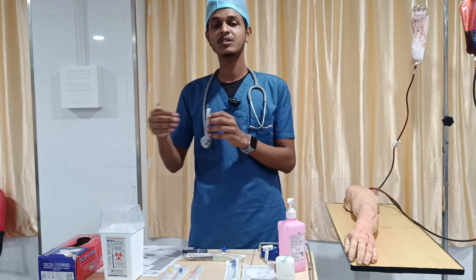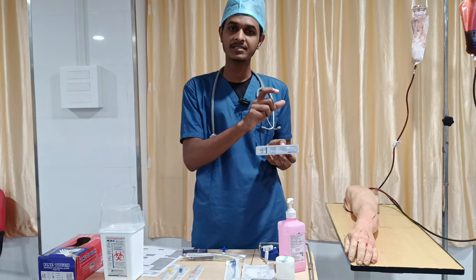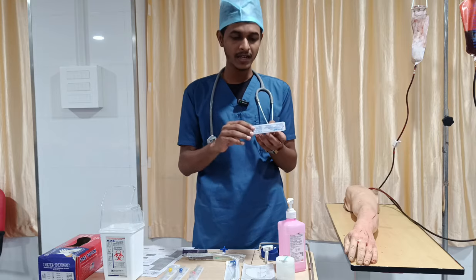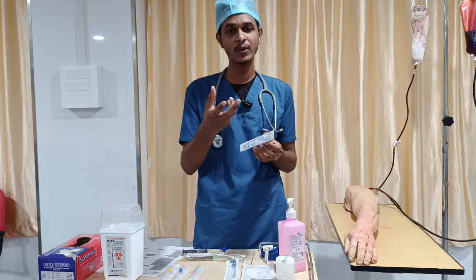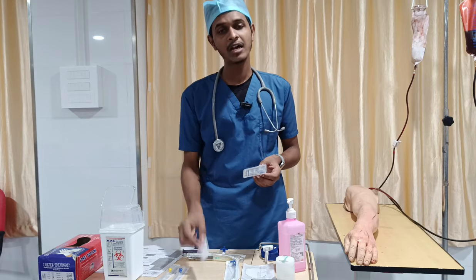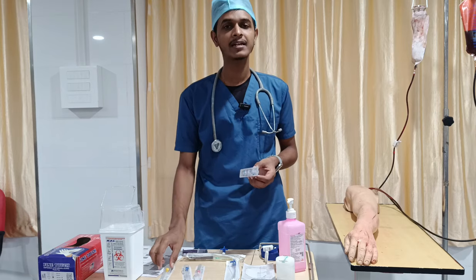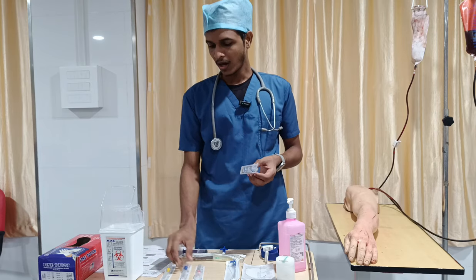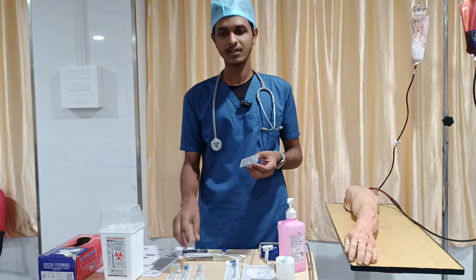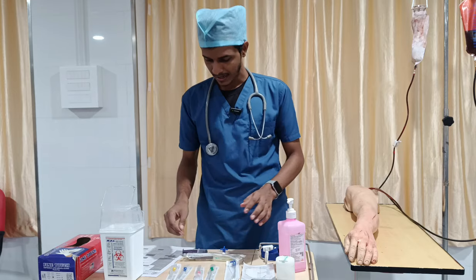If you want to administer aggressive fluid resuscitation, there also you have to choose larger size cannulas, like 14 or 16, or commonly we will use 16 and then 18. If you want to administer only fluids, mainly in the case of adults, you can choose 20, that is pink, or 22 blue. In the case of pediatrics, we will go with 22 blue, or majorly 24 yellow or 26 violet, which are the common choices for pediatric cases. So this is what we have to remember regarding cannulas.